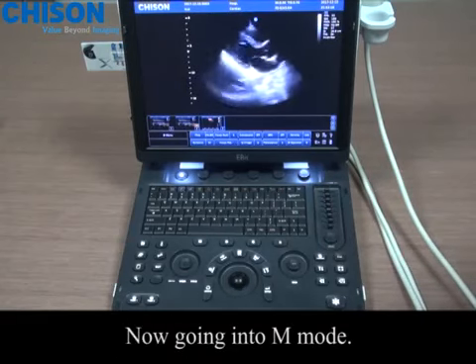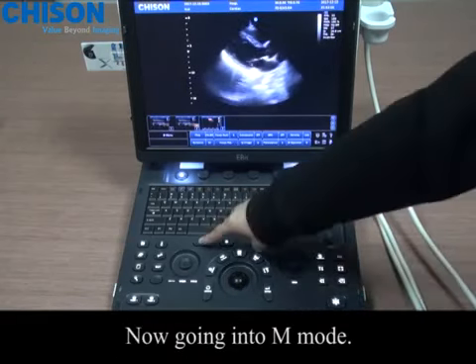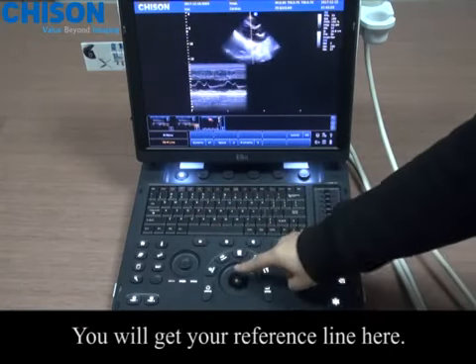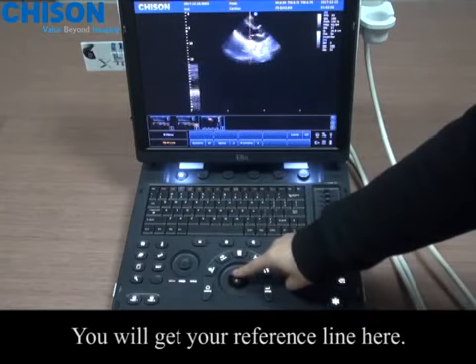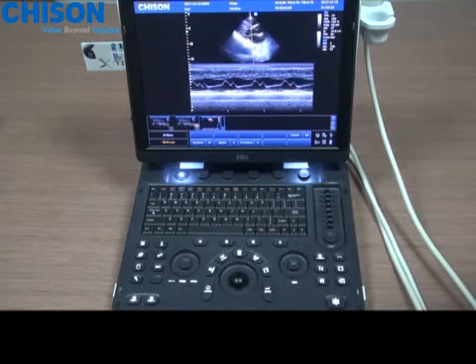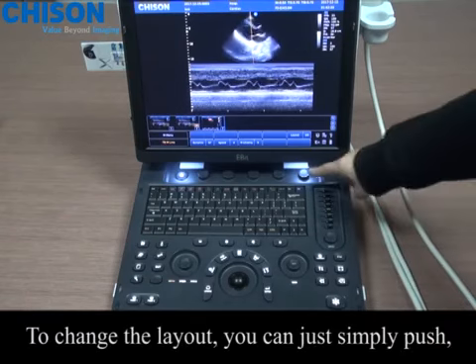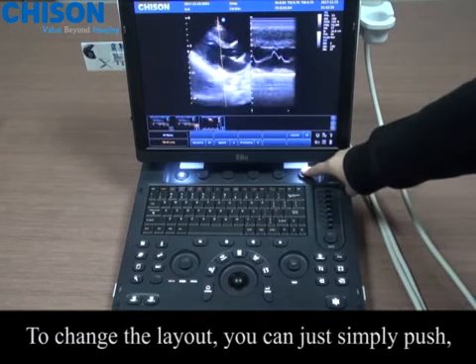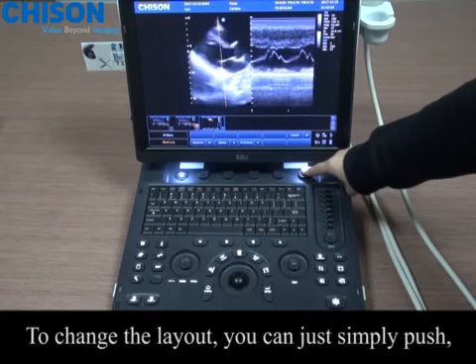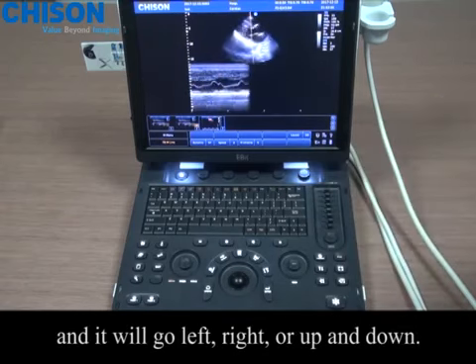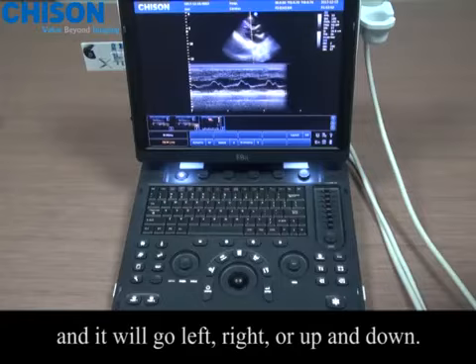Now going into M mode. You will get your reference line here. To change the layout, you can just simply push and it will go left or right.